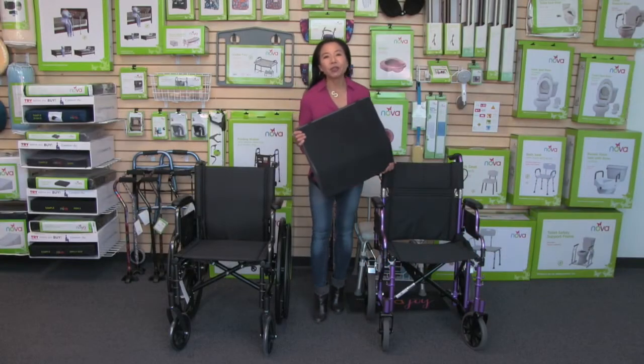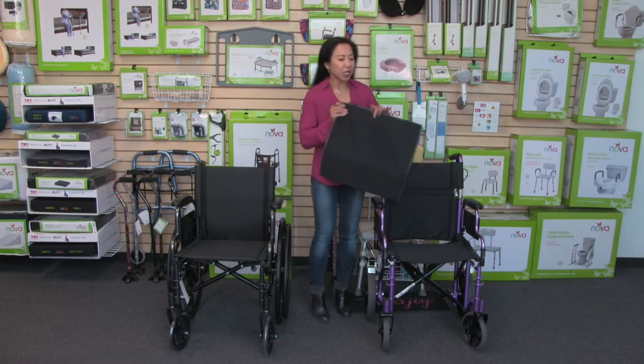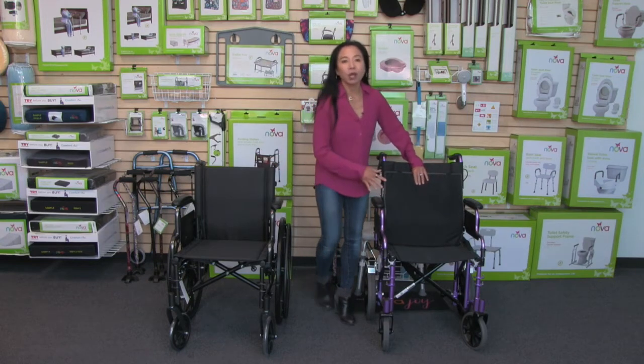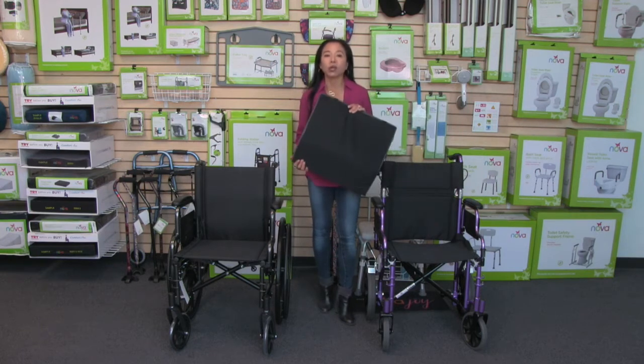This video is about the Nova wheelchair or transport chair lumbar back cushion. The shape of this lumbar cushion fits ideally for a transport chair or a wheelchair, and it's got that curved lumbar support and cushion for the user.